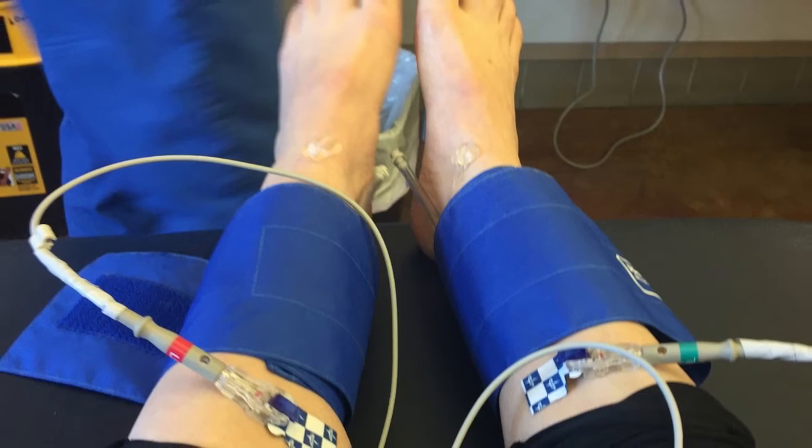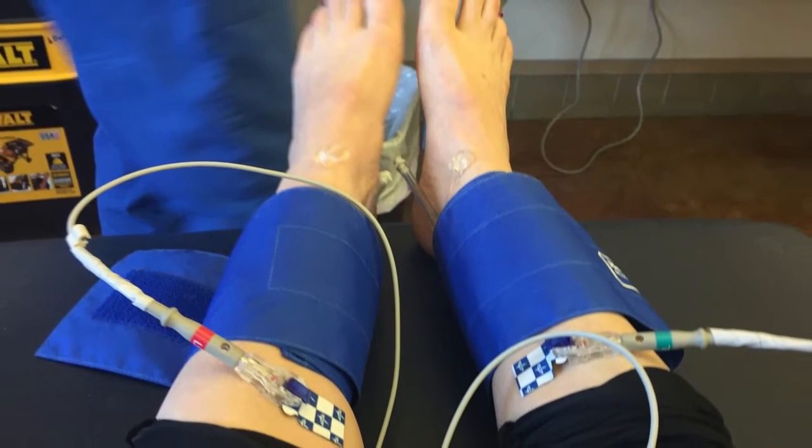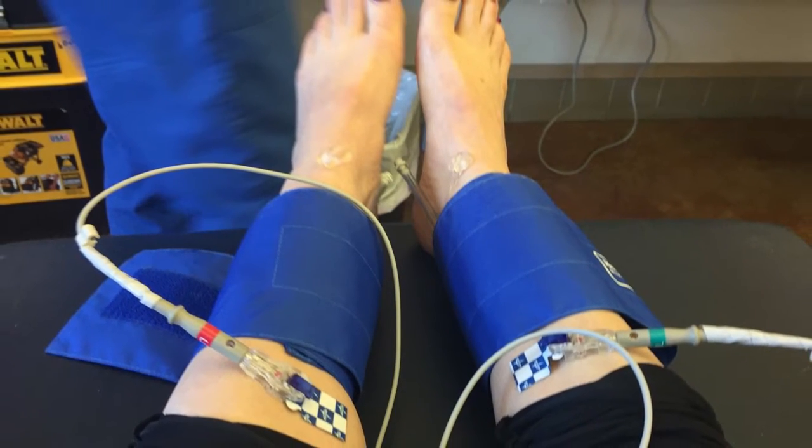A vascular technologist, just like myself, will put blood pressure cuffs on your legs and your arms. We do this so we can measure the difference between the two pressures, and we do a calculation.